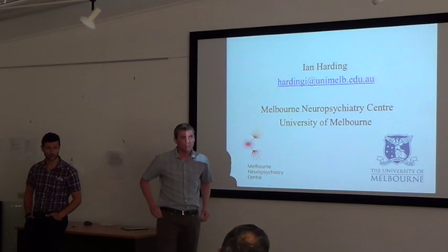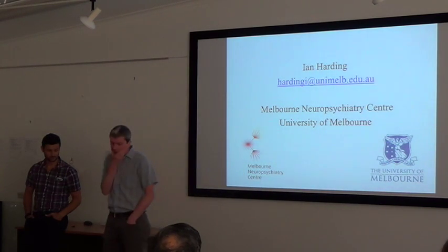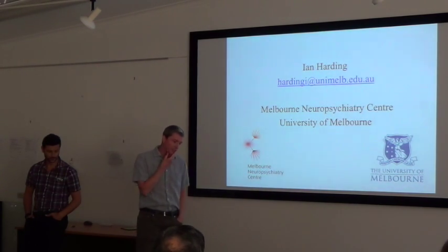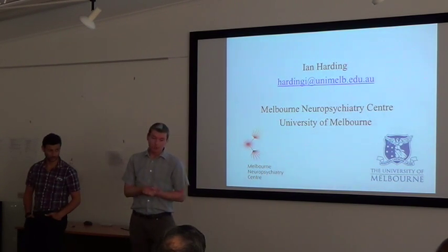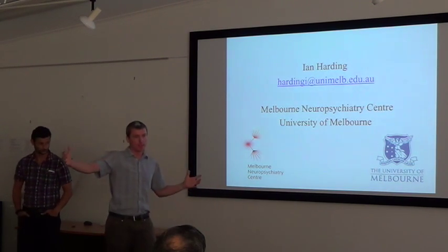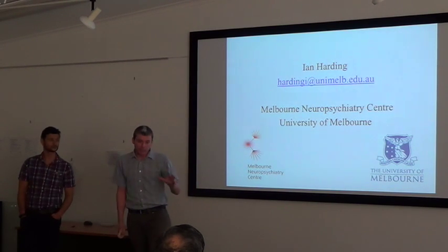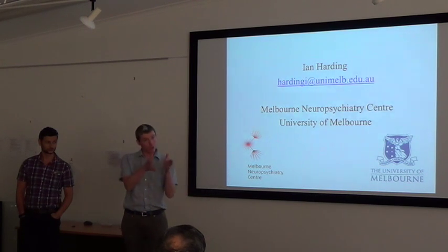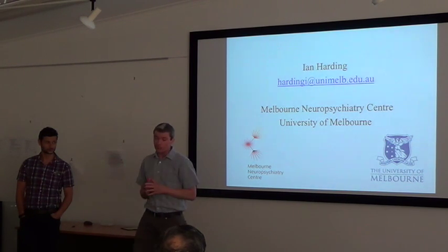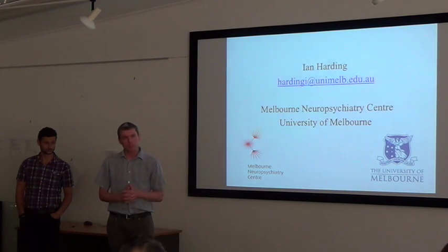Give someone a task. What's the time frame that the task has to be doing? Yeah, that's a good question when it comes to task design. There are a lot of properties of the fMRI signal that introduce noise. There's physiological noise, there's scanner drift, we call it. So we can't do long extended periods of one task and then long extended periods of another, because that gets lost in our noise. Generally, we try to get 20 to 30 seconds of a block, and switching between blocks. You can go up to about a minute. Beyond a minute, you're probably starting to run into problems.